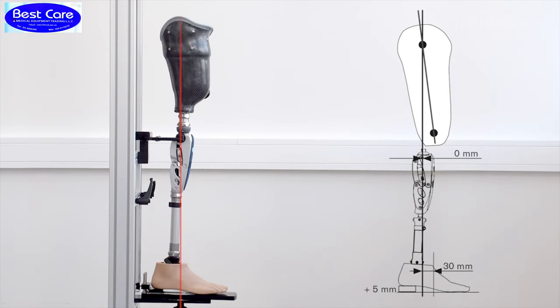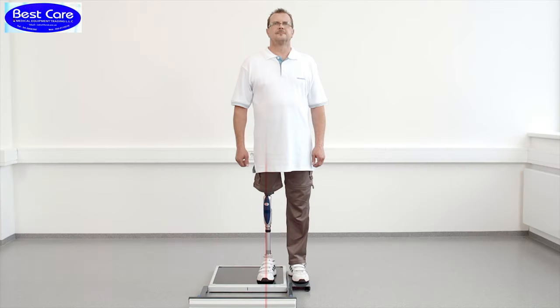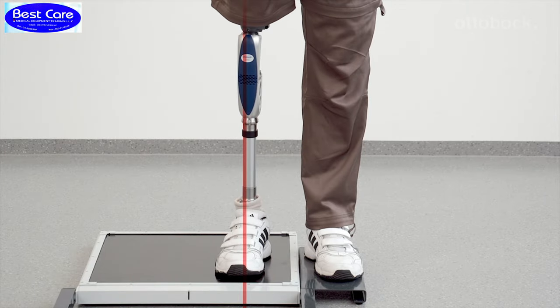For the correct bench alignment values, please refer to the displayed table. In the frontal plane, the load line runs through the middle of the prosthetic foot, the middle to outer edge of the knee, and the middle of the socket.